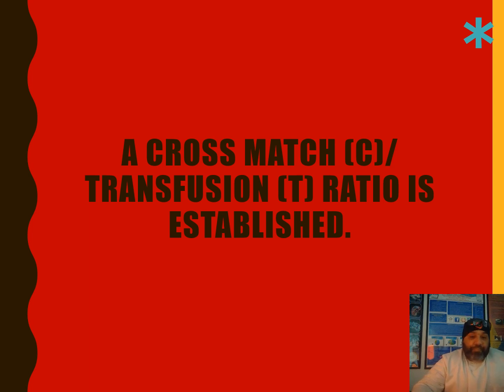And generally, in transfusion laboratories, there are procedures that ensure, apart from safe practice in and around transfusion, there are also procedures in place to ensure that health professionals on the front line again are informed of that, but also where those on the front line cannot abuse the request, in and according to transfusion guidelines of practice, but also in relation to general hematology as well.